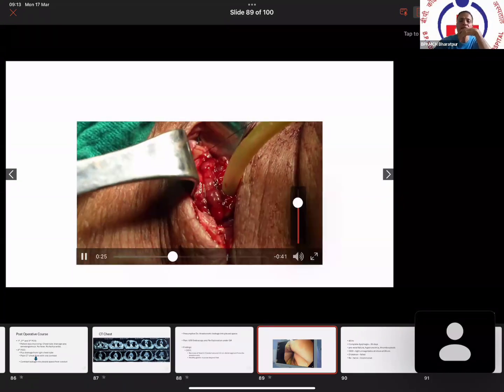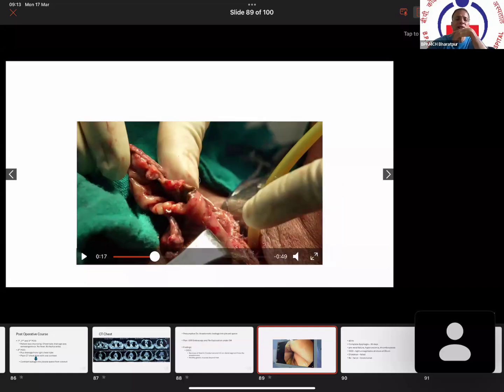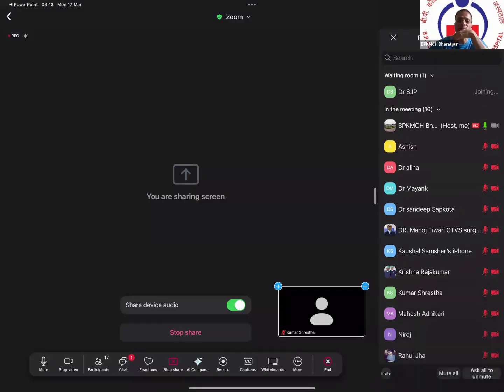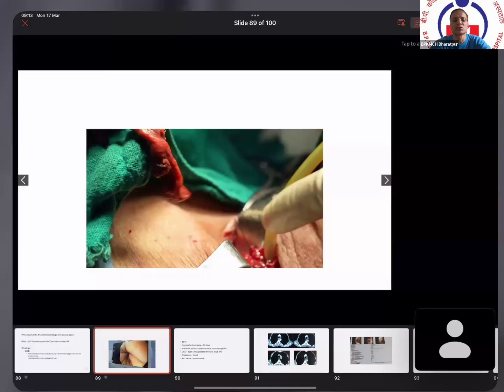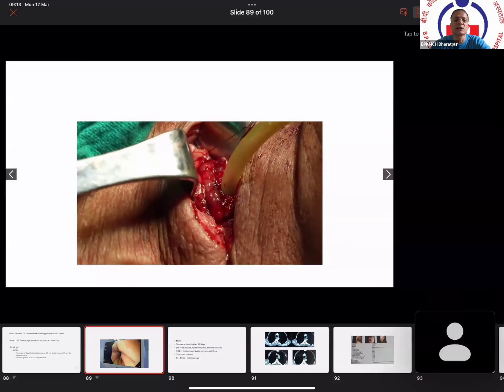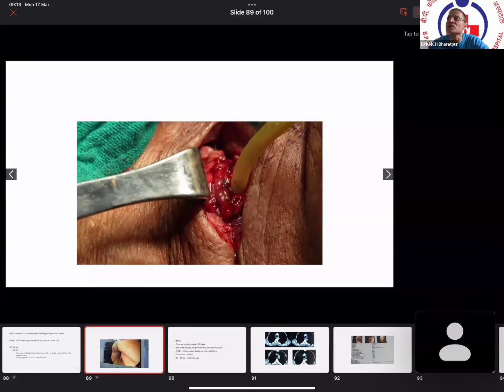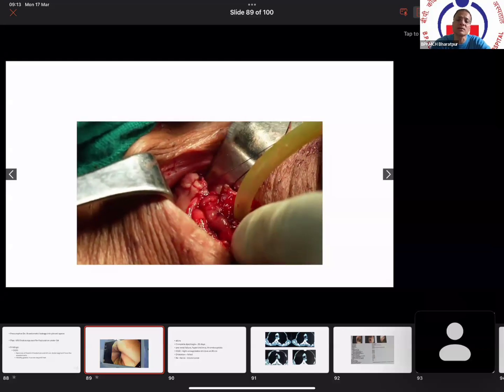Here we can see in the same patient, we excised the necrotic part. There was a lot of necrotic part. We took the necrotic part here and excised it. And then we re-anastomosed: we pulled up the stomach again into the neck, and then we made the gastroesophageal anastomosis again in the neck. That is done if possible, because otherwise we have to end up with a gastrostomy and an esophagostomy, which may be very troublesome for the patient.